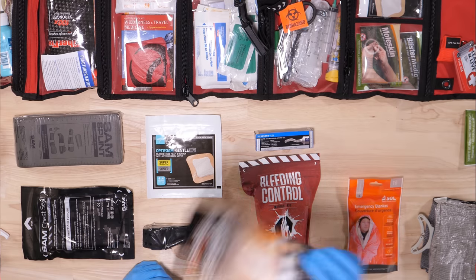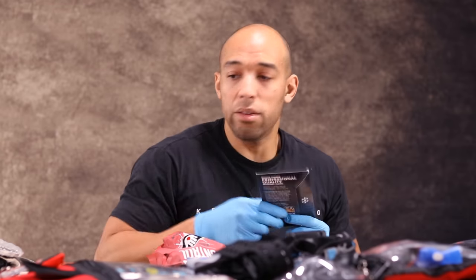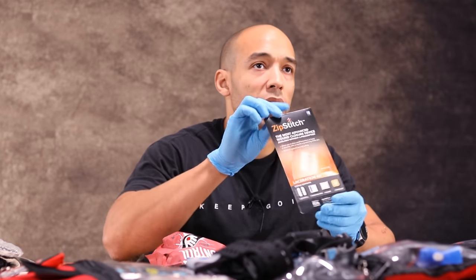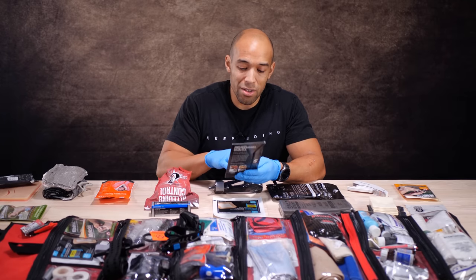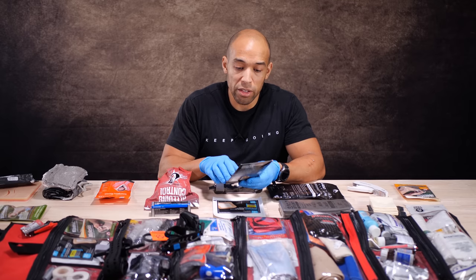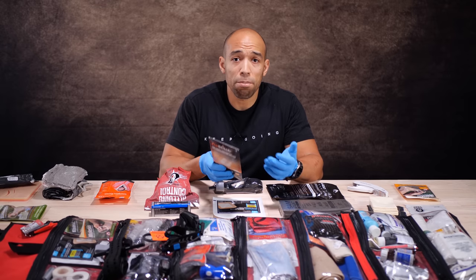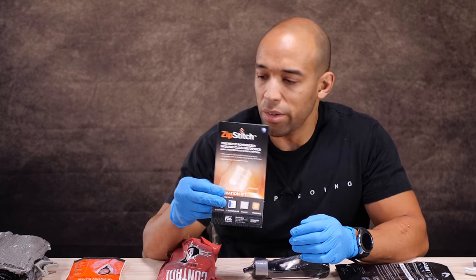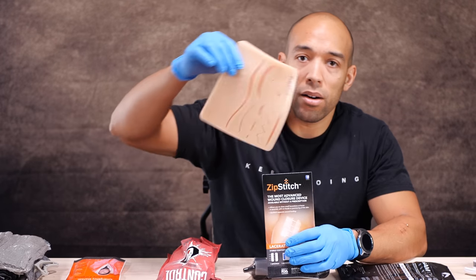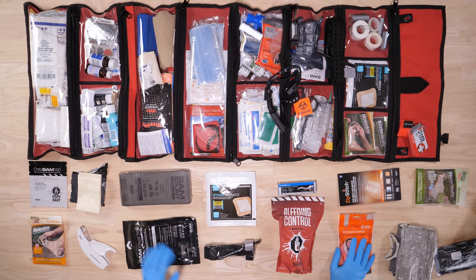Up next is the Zip Stitch — I've talked about this before but never actually used one, so we're going to demonstrate it today. Basically what this is is a non-invasive laceration kit. You get a Zip Stitch device, an alcohol wipe, a piece of gauze, and a bandage — everything you need to close a wound without relying on sutures or staples. They claim it's eight times stronger than a suture, so I'm really curious to test that out on our fake rubber skin here.